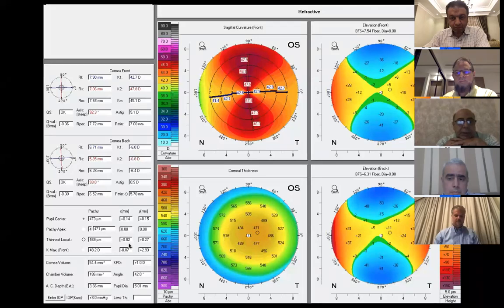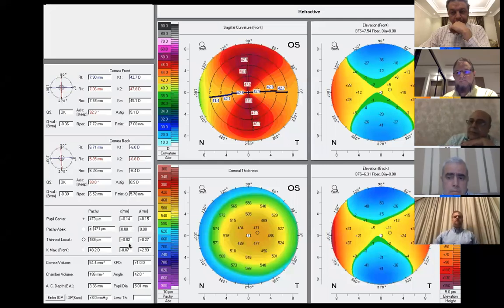First, we'll think of surface ablation. The K reading is okay, I think, because the spherical equivalent allows it, it will be far from 34. But we have to calculate the total refraction with the mesopic pupil of 5, I think.